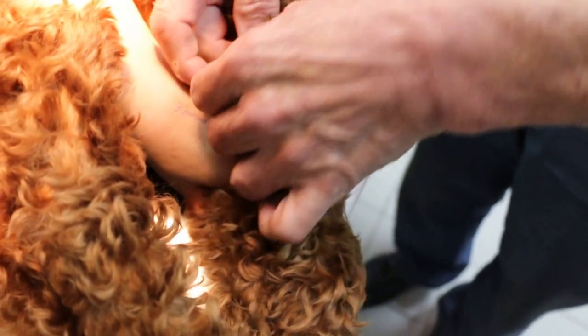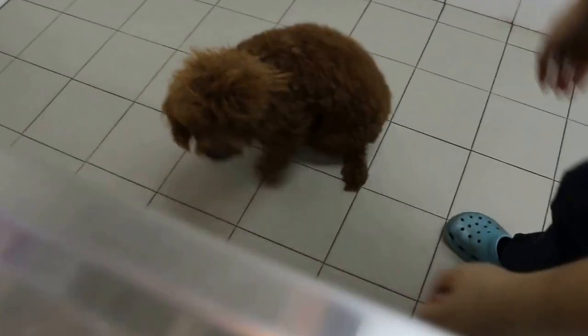Not need the x-ray? Must x-ray. The dog will move on and leave the cast for eight weeks, even ten weeks. We still x-ray first. Put on the floor and see if it can walk. Can't put on the floor, can't walk. Because the moment you put it down it will come out — luxated. Okay, x-ray. Two legs.